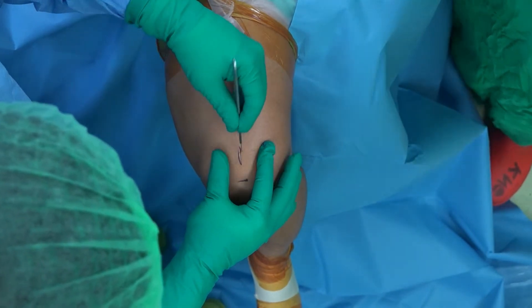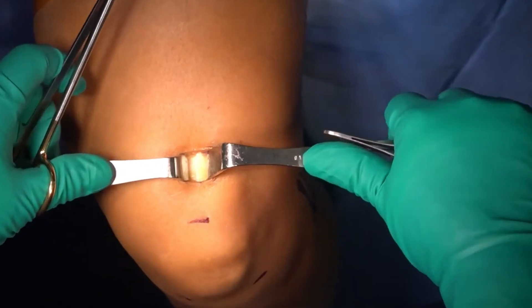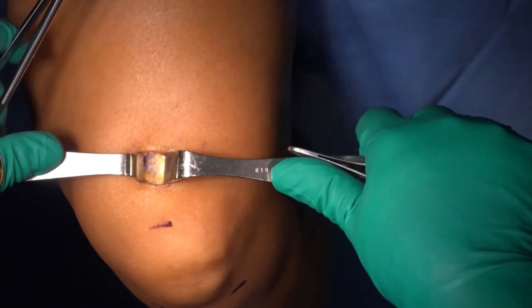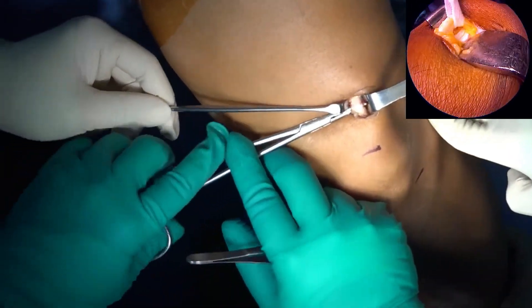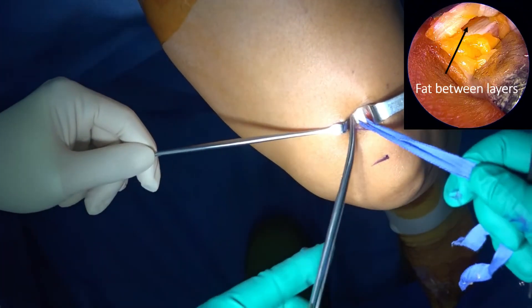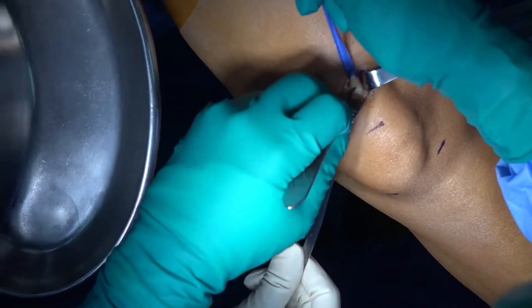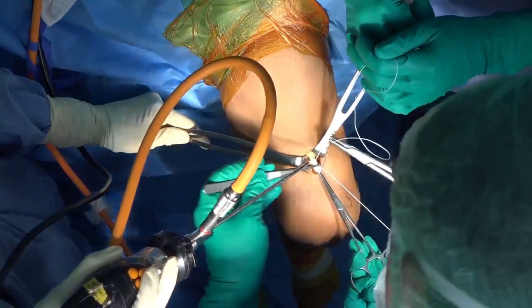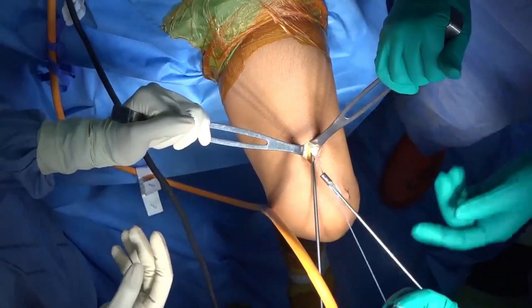Identify the superior pole of the patella and make a vertical incision two centimeters above it. Identify the quadriceps tendon. Identify the separation between the superficial and deep layers at this point, where a layer of fat tissue will be visible. Cut through this layer, ensuring that the two centimeters of quadriceps tendon above the superior pole of the patella remains intact. Suture the tendon, then perform tendon stripping.